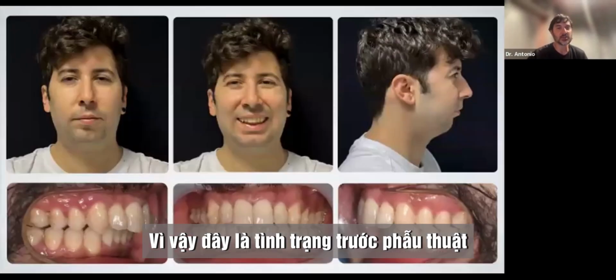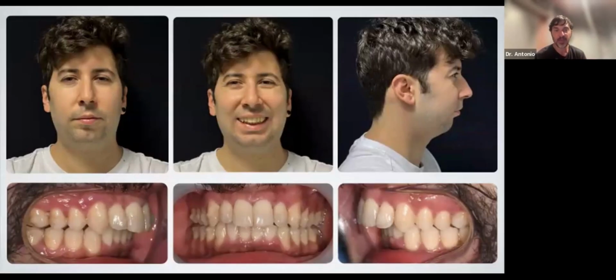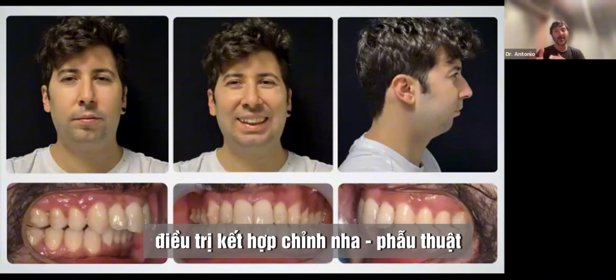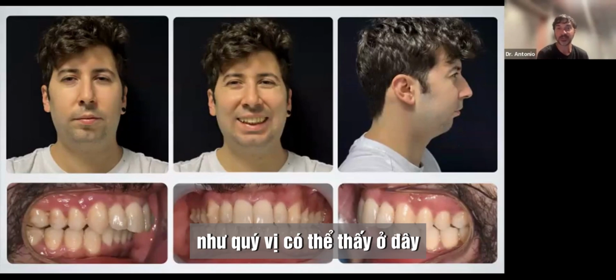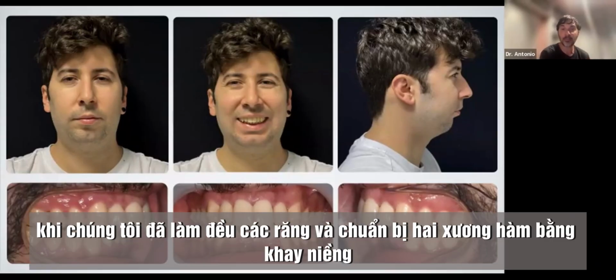So this is the situation before surgery. He was highly motivated by the prospect of improving his facial appearance. And so together with the patient, we decided to proceed with a combined orthodontic surgical treatment using clear aligners for pre-surgical orthodontic preparation. As you can see here, that's the situation just before surgery, when we have aligned teeth and prepared the jaws with aligners.